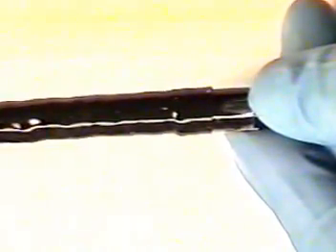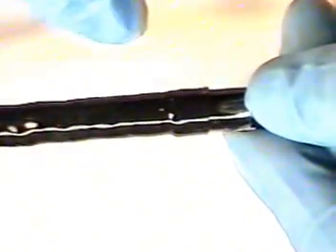We will now show you the bending rubber binding sequence again on the second glue joint using a white thread, but be sure to use a black silk thread. Make a loop with your binding thread. Cover the loop with your thumb. Take the longer strand of binding thread and make 3 to 4 turns away from your thumb.